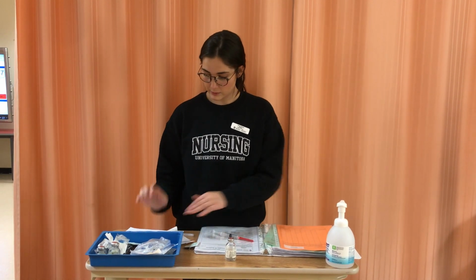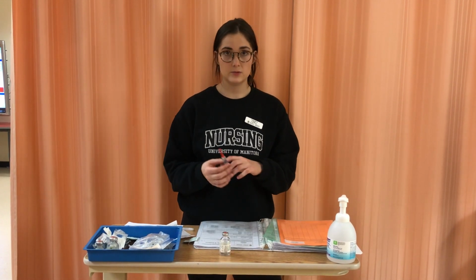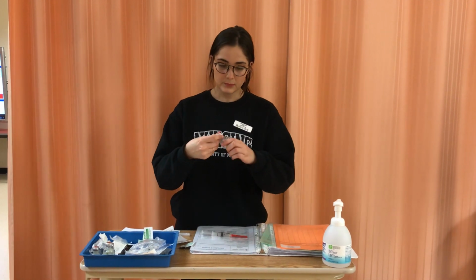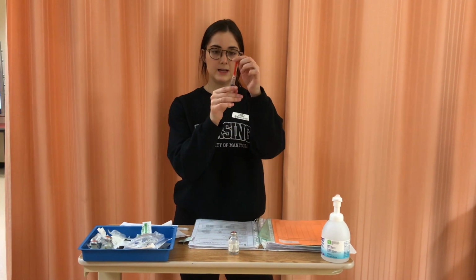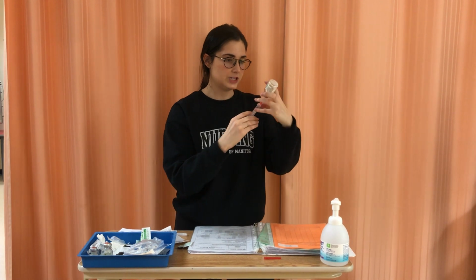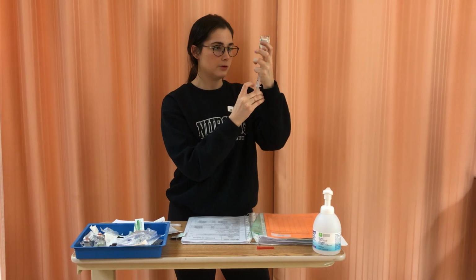So with our calculation that we did before, for 3 million units, the concentration is 1 million units per ml in here. So that means we need 3 milliliters. So I'm going to grab 3. But first I'm going to re-swab, I might have touched it while I was mixing it. And let that dry and get my 3 milliliters. Okay. I'm going to inject my air and grab my required dose.